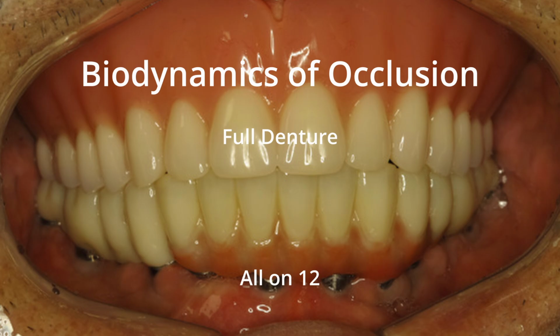So what would I do in this situation? How do we ensure long-term implant treatment success? I would place implants in the mandible and use a removable denture in the maxilla. When a removable denture is used in the maxilla, the results of AllonX treatment can be maintained throughout the patient's lifetime. In fact, many of my AllonX patients are no longer followed up because many of them have already passed away. They use their prostheses until the very end of their lives. You understand what I mean, right?